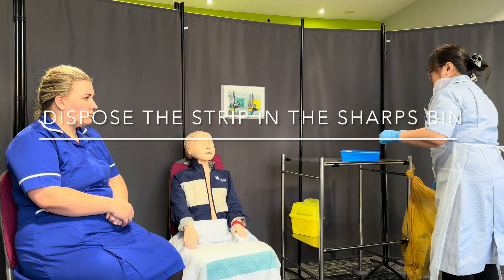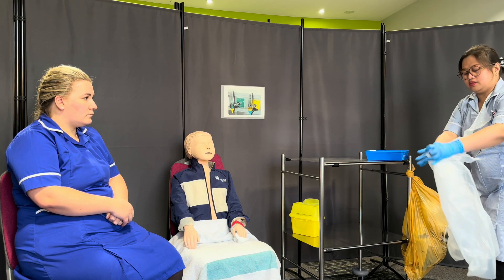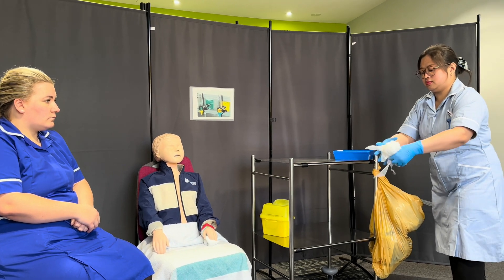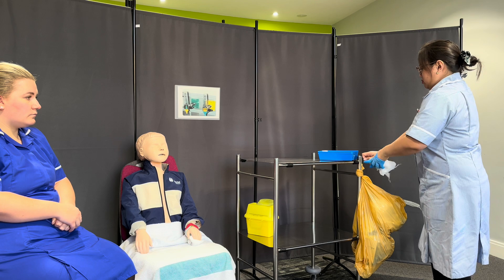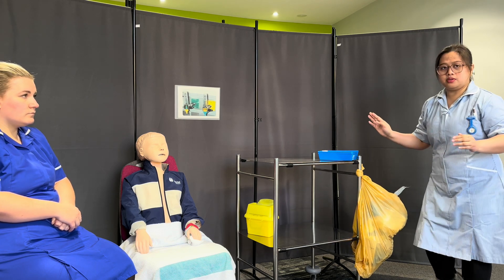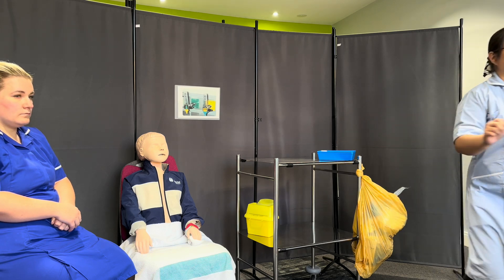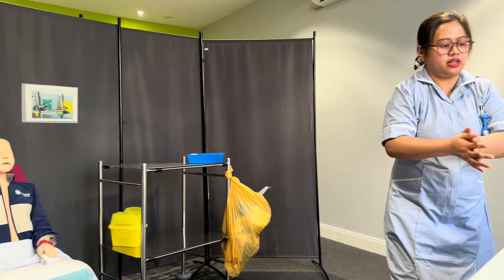I'll pop that right in. I'll also need to clean my glucometer.